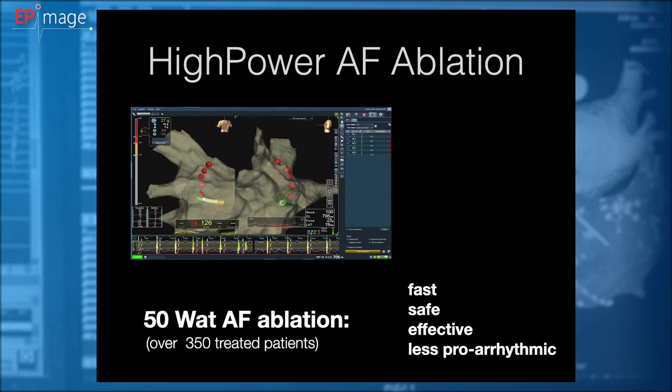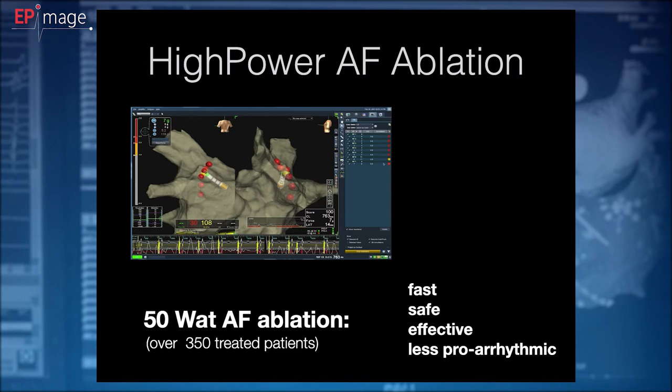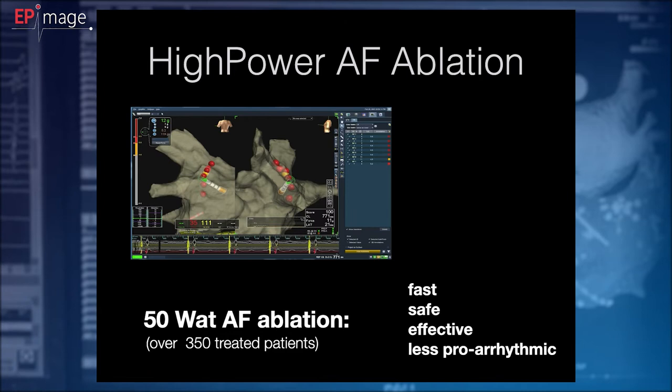From my private point of view, I've already treated over 350 patients with 50 watts. What I can say is that the ablation shortened. Needle time for me now is between 60 and 80 minutes. It's quite a safe procedure. I experienced only one steam pop in all of these patients, and I also have the feeling that it's more effective. I observe much lower arrhythmia recurrence rates in patients treated with high power, and much less proarrhythmia effect, which we sometimes observe in our patients.